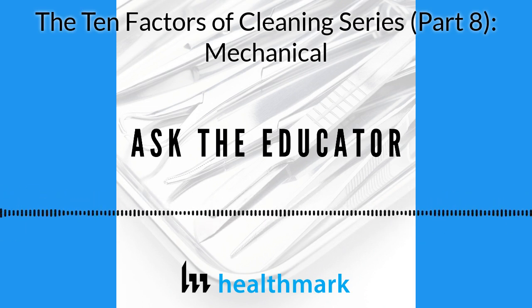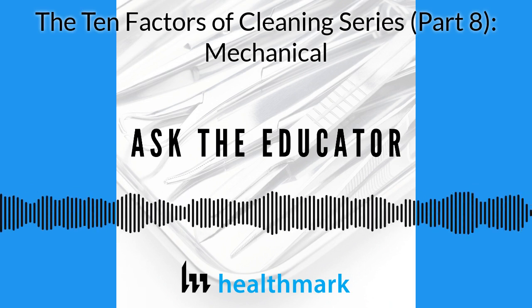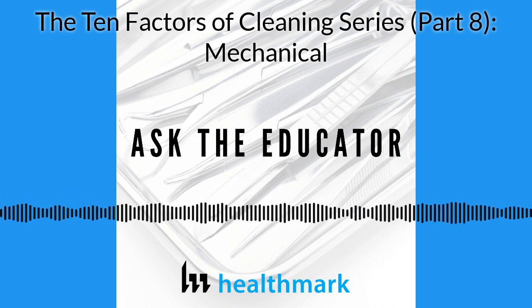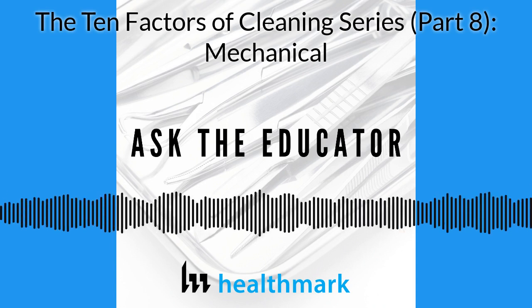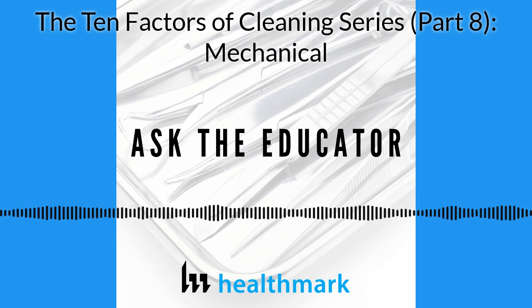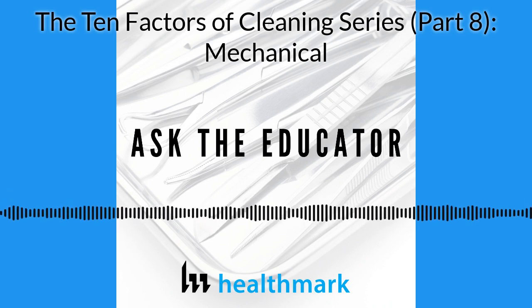So again, I wrote some articles about the cart washer. Again, we could break that down later. And then the next one is, I think after your manual process having the appropriate sinks, the sonic cleaner is the number one cleaning equipment found almost anywhere, whether it's a small rural hospital or ambulatory. Almost everybody's got a sonic of some sort, or they put some types of instruments in it. And the sonic has become so unique. And again, 20 years ago, and people say, why are you talking 20 years ago? They weren't hooking up lumens to sonics.